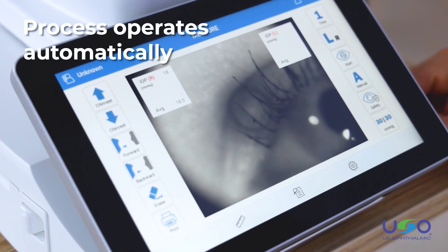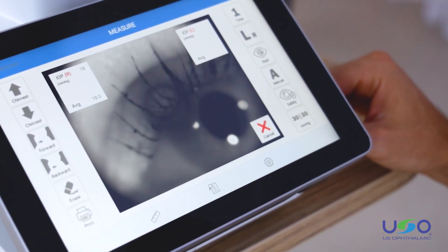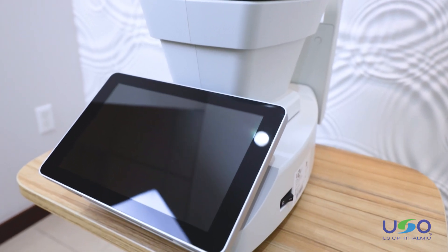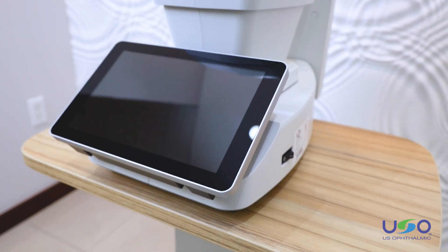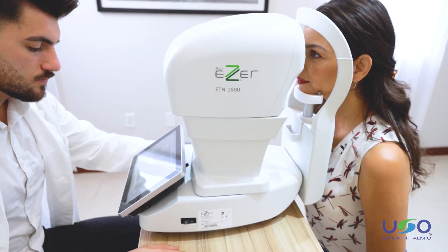The process operates automatically with a simple touch of the start button. The ETN 1800 begins by finding and focusing in on the eye, then delivers air puffs according to the quantity it has been programmed for.